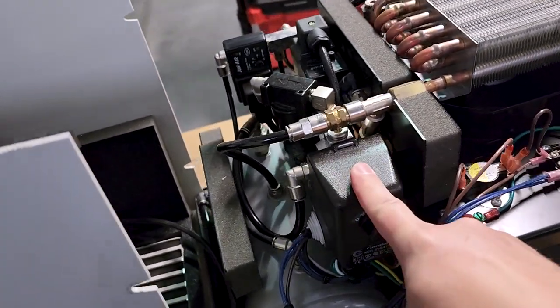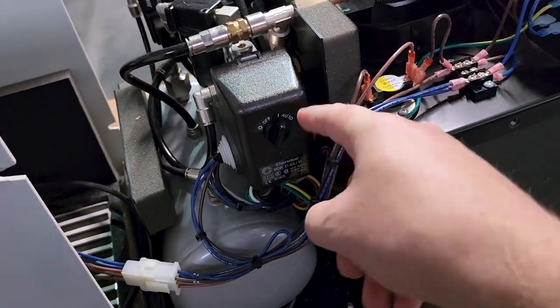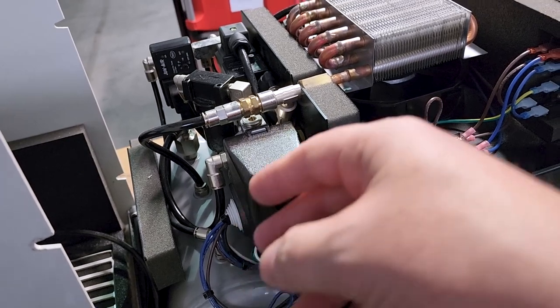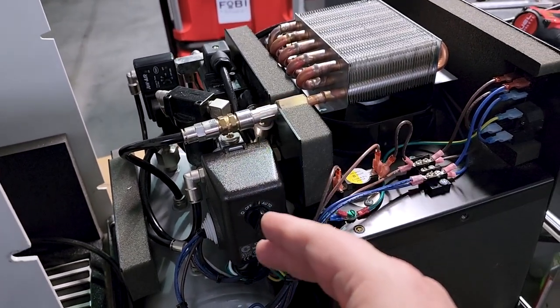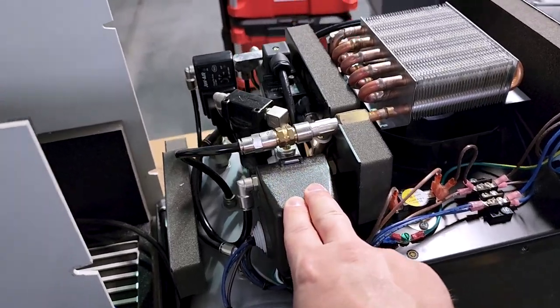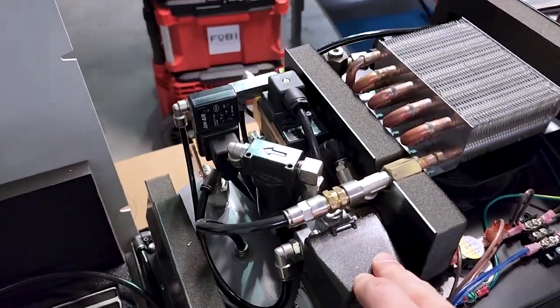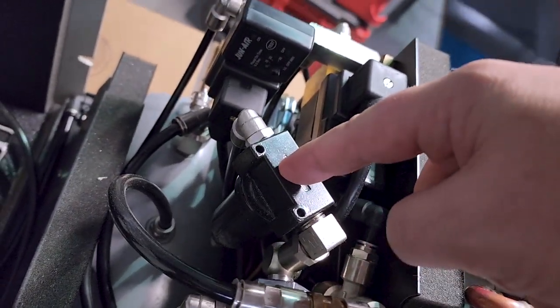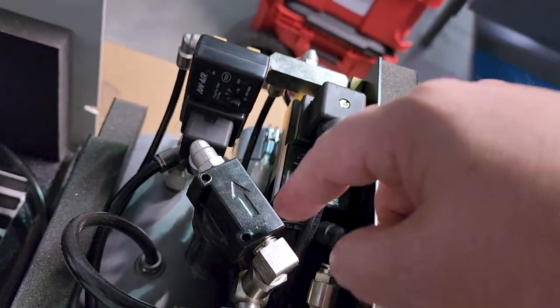So on auto, it goes to certain set points, which there should be a set of micro switches in here, which controls both your low pressure cut on and your high pressure cut off. That should be inside here. I haven't taken one of these apart, but just to be sure. So right here, we have a water separator. You can see right there, that's your pressure.